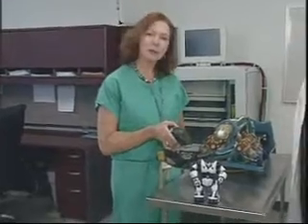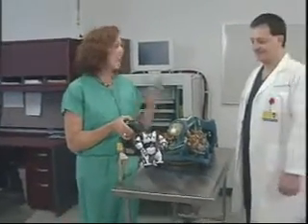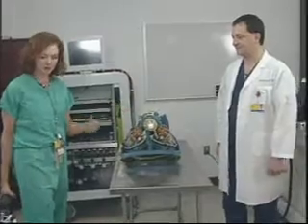Robots are being used for more and more applications in medicine, and so is magnetic resonance imaging, or MRI. But because MRI depends on the presence of big magnets, robots and MRI have what might be called a fatal attraction. But Dan Stoianovici and colleagues at Johns Hopkins have developed a robot that is MRI compatible.